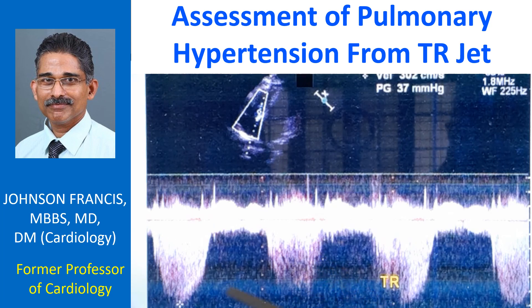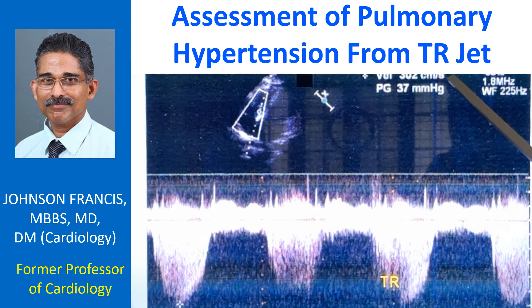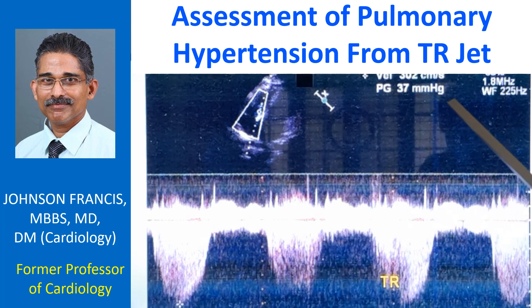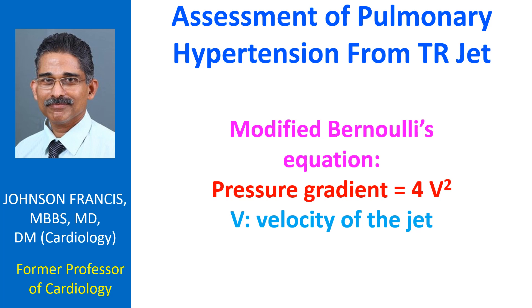You calculate the gradient from the velocity. Peak velocity is calculated here as 302 cm per second and the corresponding gradient has been calculated by the machine as 37 mmHg. Calculation of gradient is based on the modified Bernoulli's equation: pressure gradient equals 4V squared, where V is the velocity.